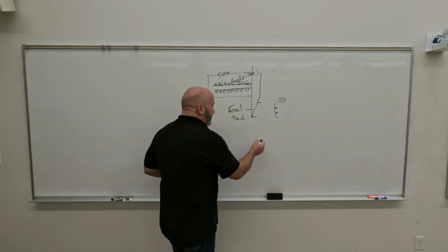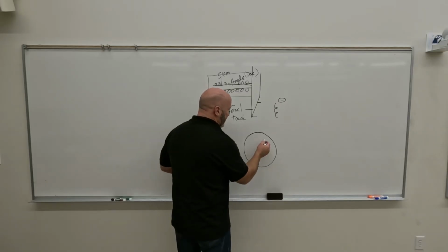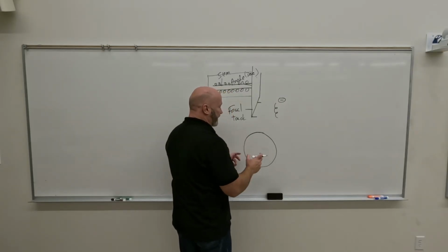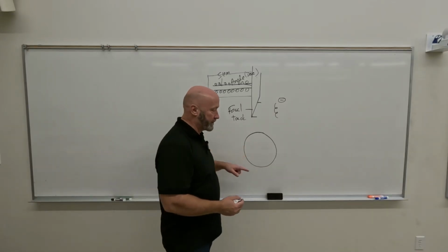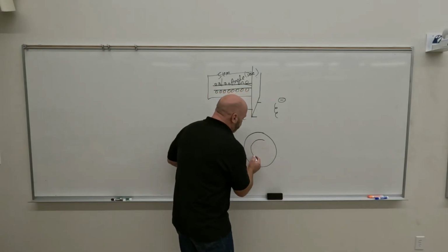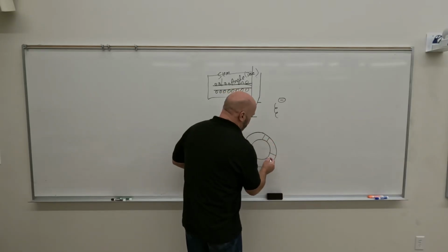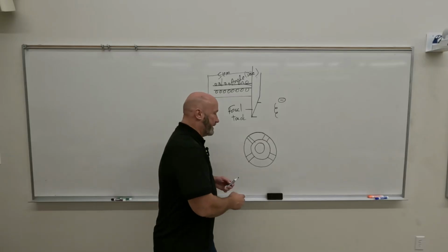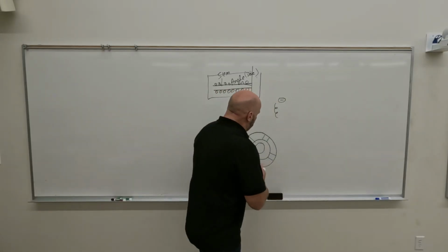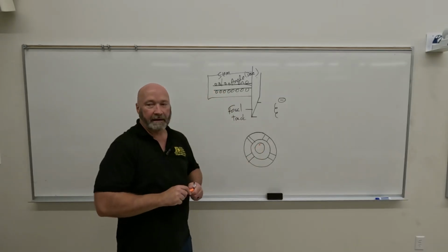So think of it not exactly as you saw the induction motor, but think of it as being this thing, and it's got discrete individual electromagnets instead of one coil of wire going through a whole bunch of holes. Imagine it having just a number of induction motors. It's got one here, and one here. We're just going to do 4 of them. One here, and one here. And the stem is there. And in the stem, you've got some sort of ferromagnetic material. Ferromagnetic, if you remember, easily attracts magnetism, right?